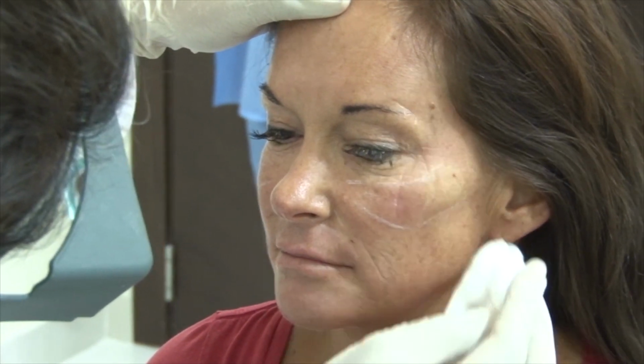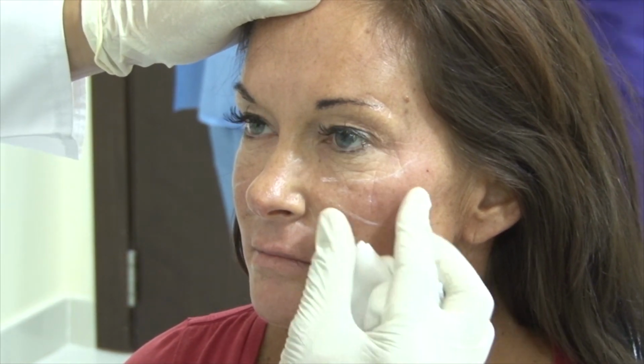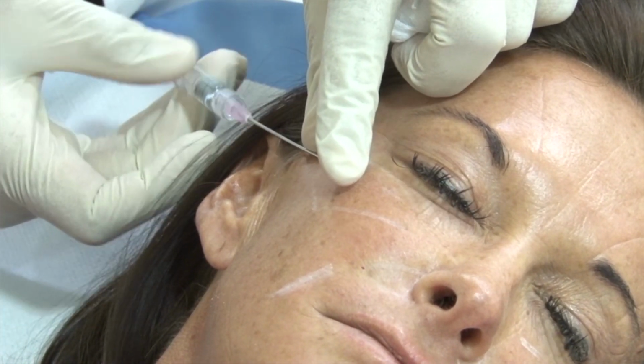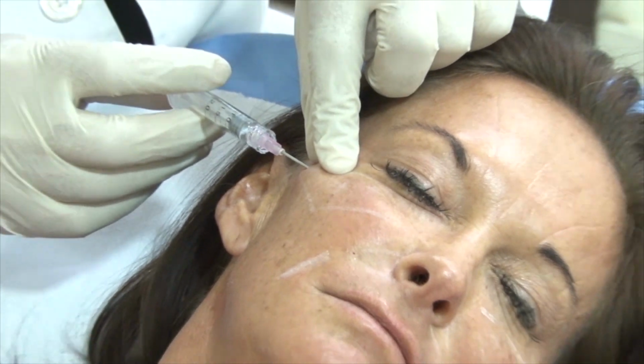Then make the patient sit up and assess the symmetry and volume. After assessment, I will add 0.2 ml more, particularly where there is a tear trough deformity or submalar depression.